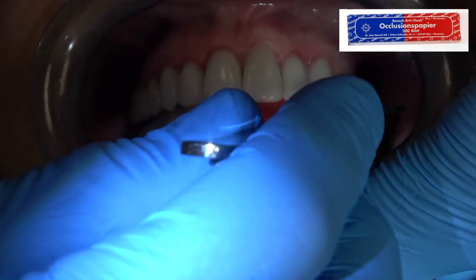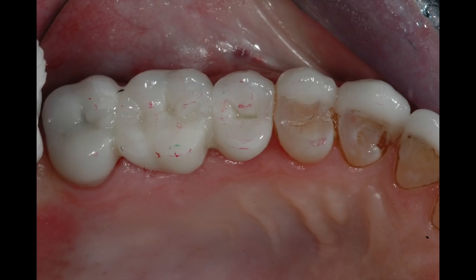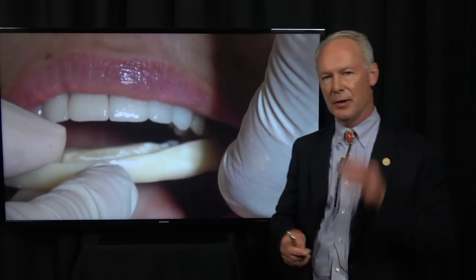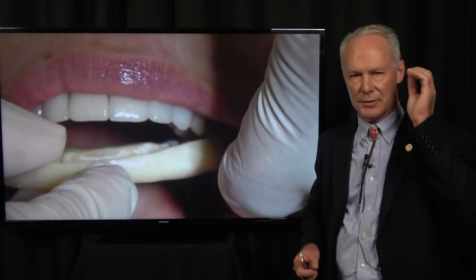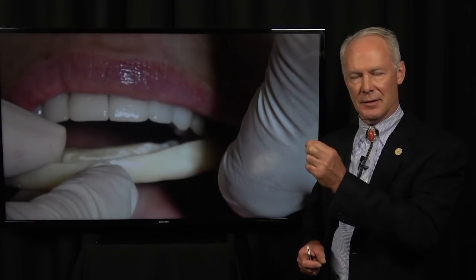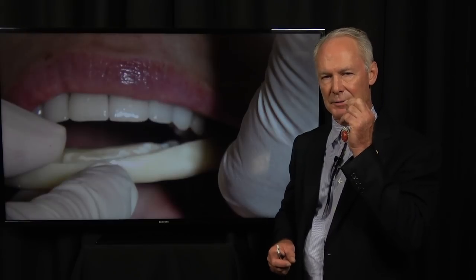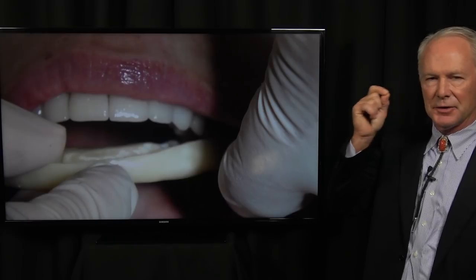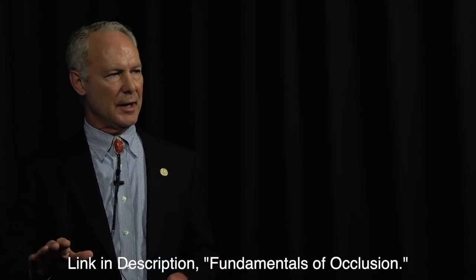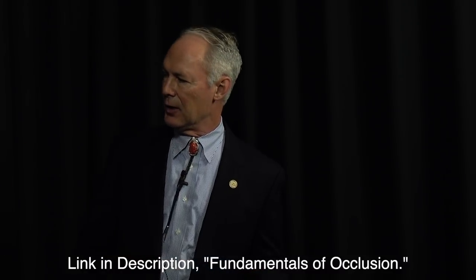Check the occlusion — that's the final occlusion. I'm going to buff it with a Shofu gray rubber wheel and drip water while doing that. The goal for occlusion: I want to be able to move shim stock between the second molars and the distal of the first molars, and I don't want the contact on the mesial of the first molar or the bicuspid to be any firmer than that of the cuspids. Take the second molar and the distal of the first molar slightly — a shim stock thickness, which is one-half of one-thousandth of an inch — out of occlusion.